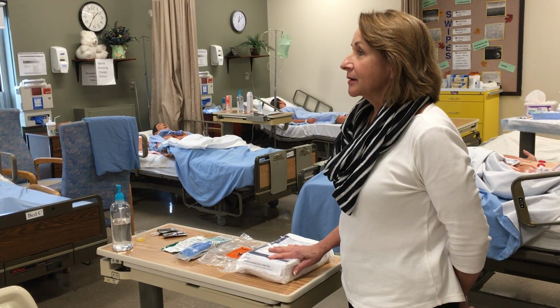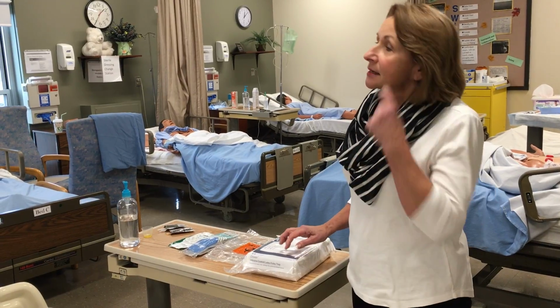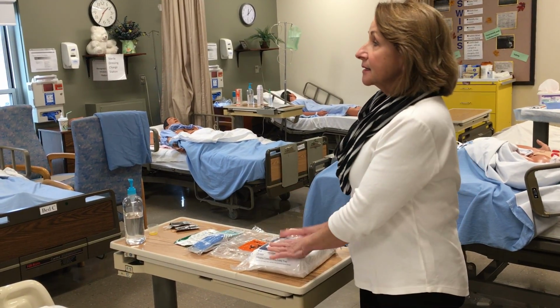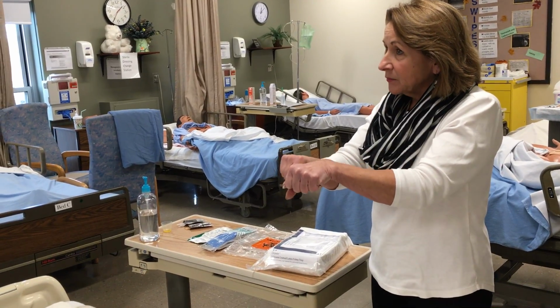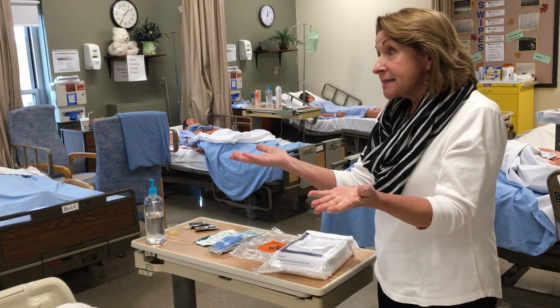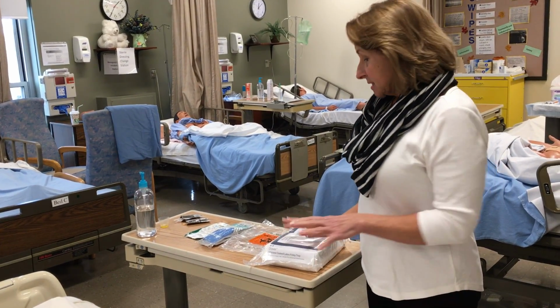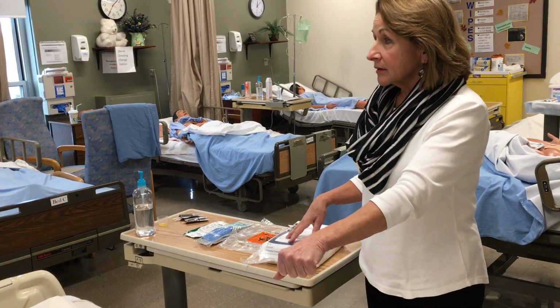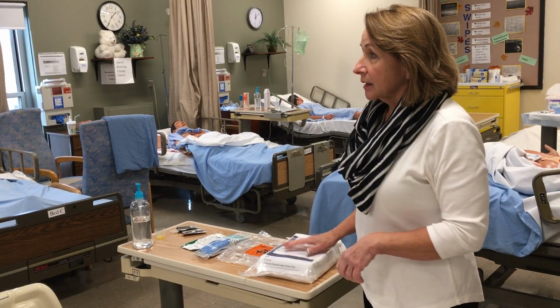Okay, what are we doing today? What is your kit? Oh, open and closed as in the appliance is attached to the tubing. Yes. So in a closed system kit, the catheter's already attached to the drainage bag. Why do we want to do that? Less risk of infection. Correct. But you still might see an open catheter insertion done. If that's true, you have your catheter kit, and then you need to get a drainage bag, and somewhere during the procedure you're going to connect the two.